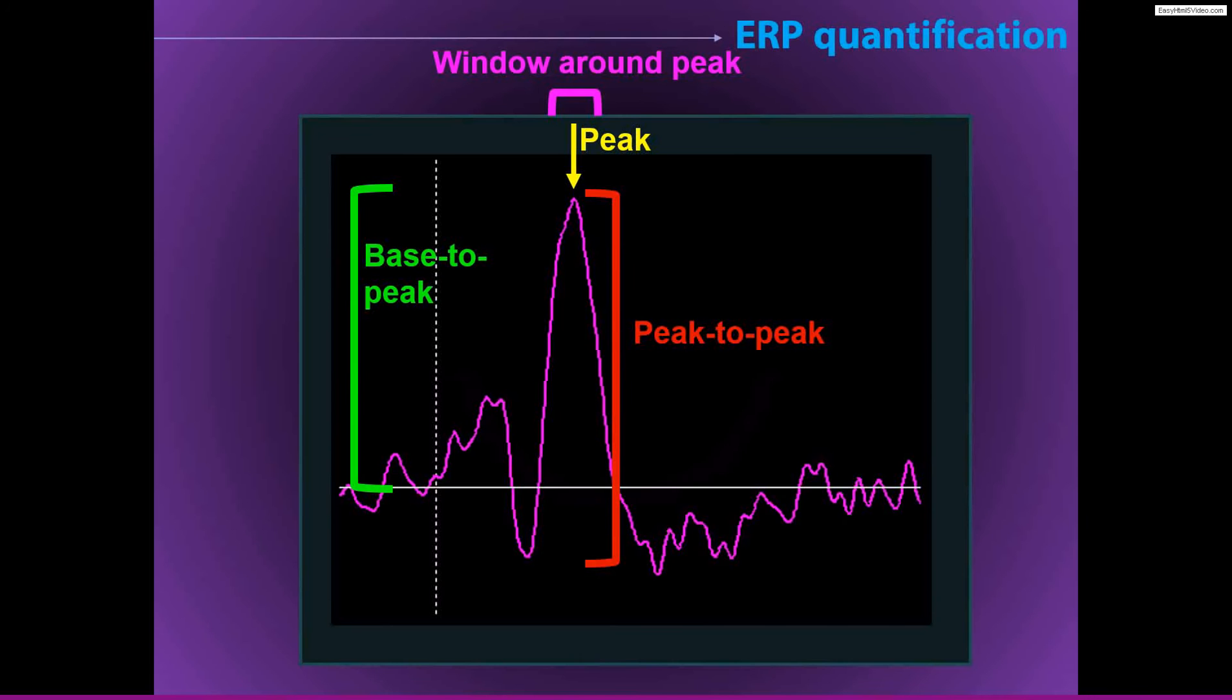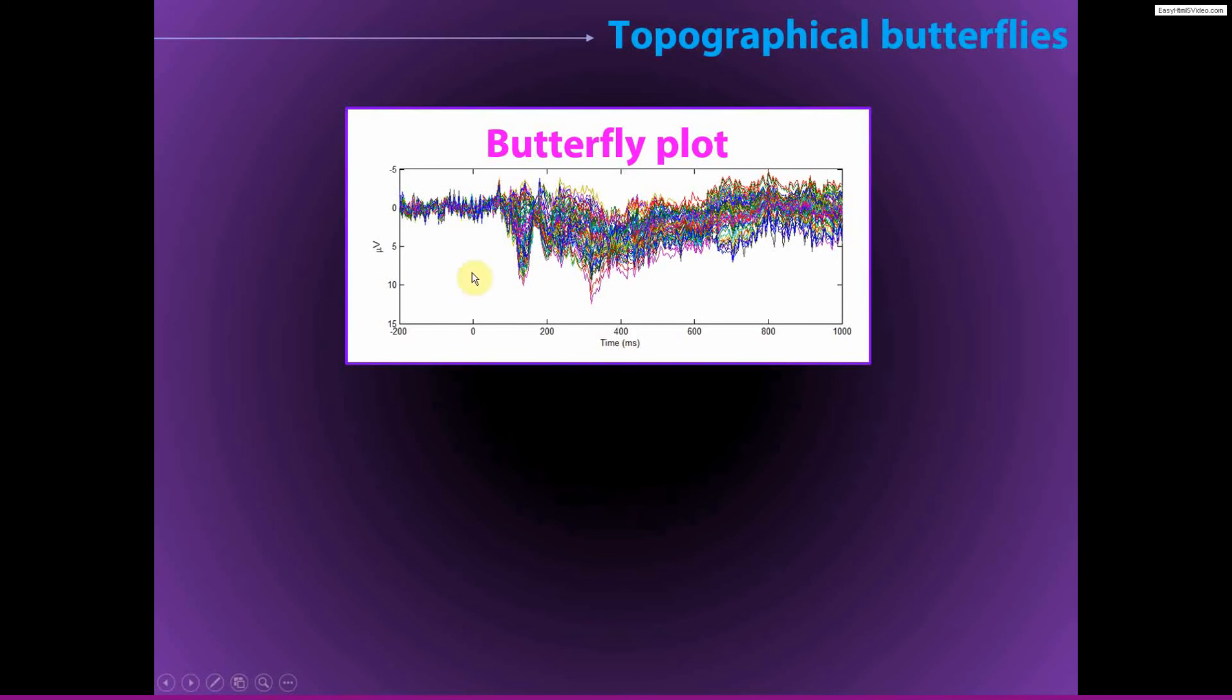So this is the ERP just from one single channel. Here you see the ERP plotted from all of the channels. So in this data set, we have 64 channels. So there are 64 lines being plotted on top of each other. And this is called a butterfly plot for reasons you can use your imagination to try and understand.